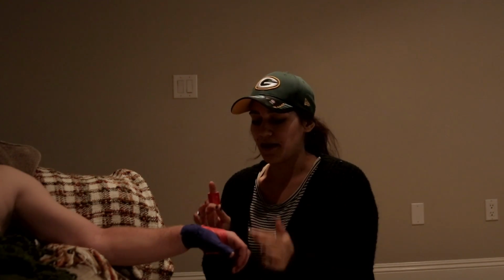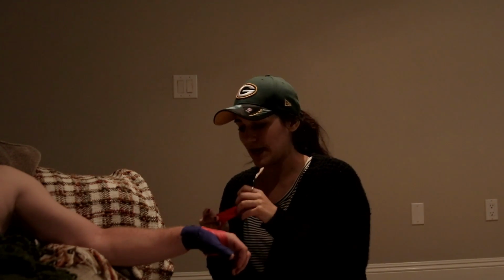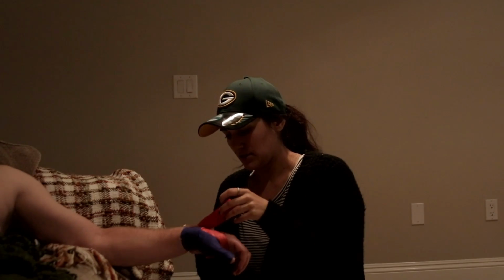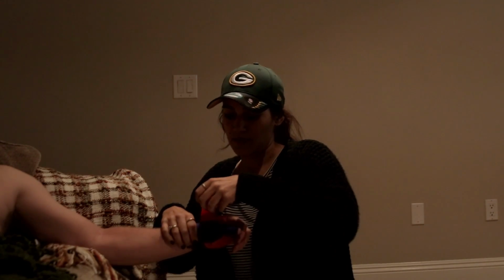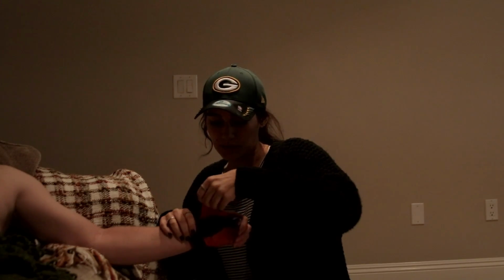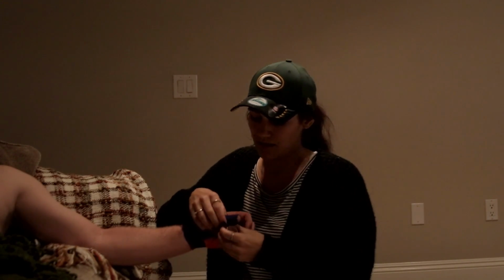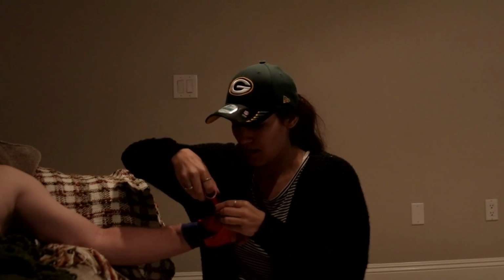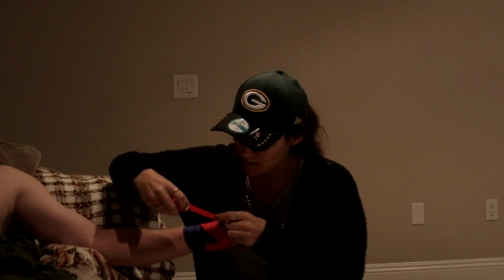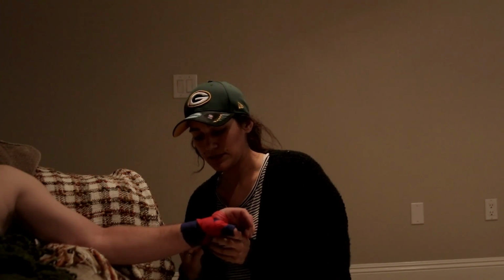So after you've locked it in, you're going to go ahead and do a thumb spica, and you're going to do it 3 times. You're going to start on the ulnar side of the wrist. The carpals. I'm going to bring it around the thumb. Down. And to the starting point.